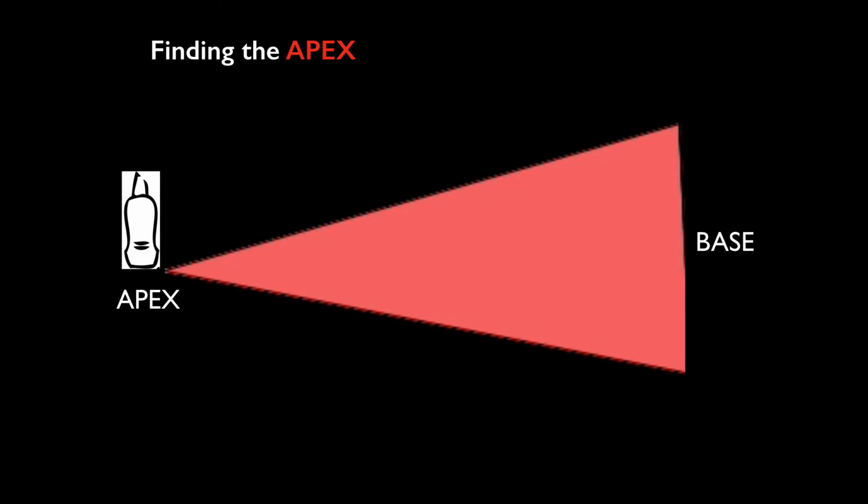ultrasound image. And eventually what I call falling off the cliff, where it falls off and you see no ultrasound image. So what you can do is slide your probe and see the circles getting smaller and smaller until it disappears, and that's how you identify your apex. And make sure you're continuing to stay perpendicular to the heart. Remember to get perfect circles as you come down. And if you tilt your probe on that apex right there, then you get your apical four-chamber view.